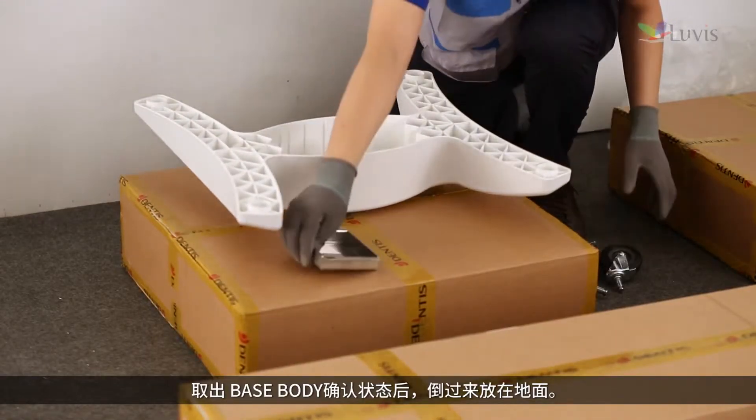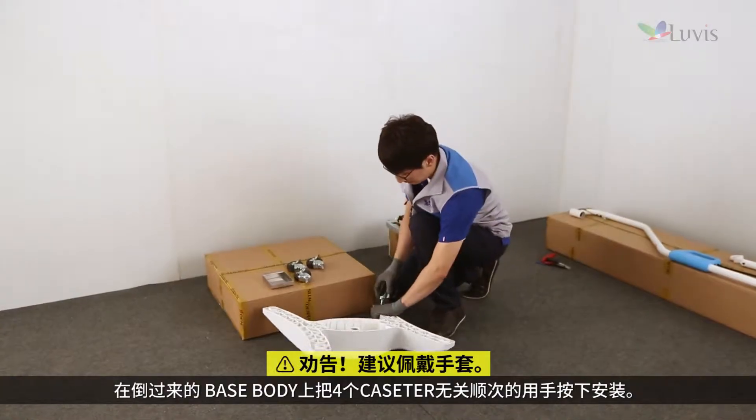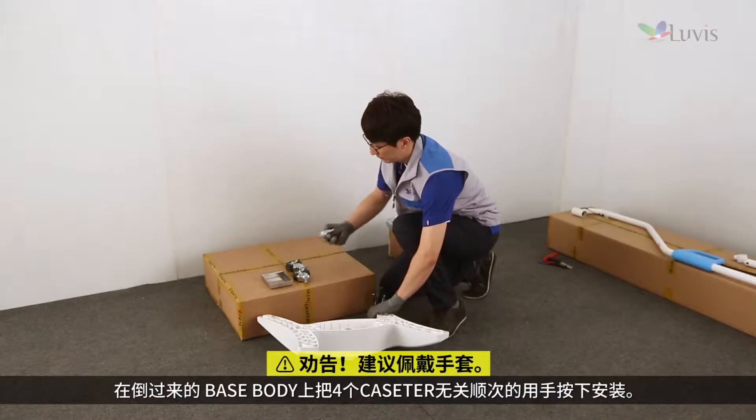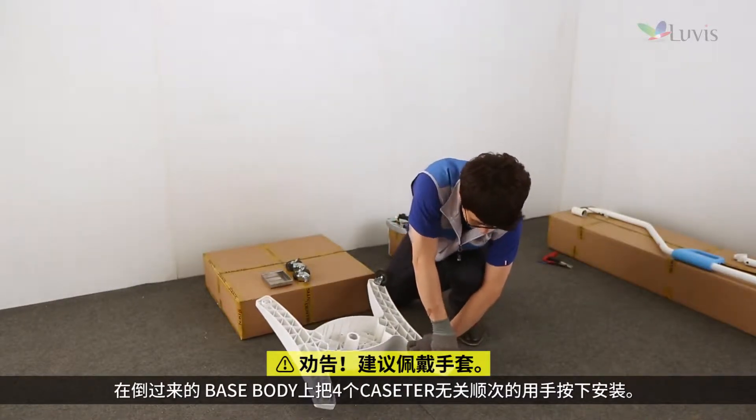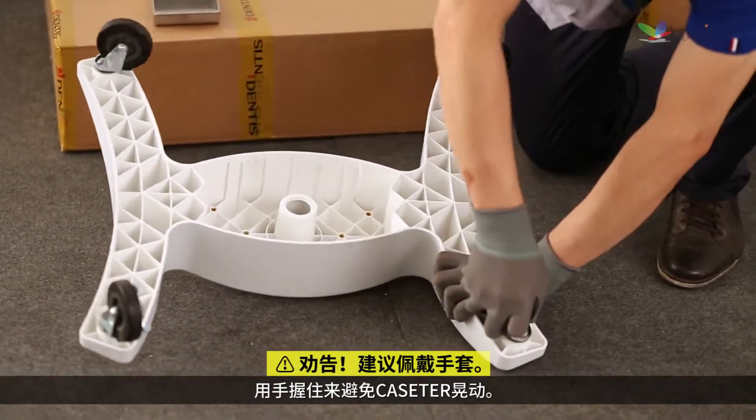Open the base body box, take out the base body and check it for any damage. After that, turn it over and place it on the floor. Insert four caster cassettes into the turned-over base body, regardless of sequence, while pressing with your hand. Hold the base body tightly to prevent it from moving.